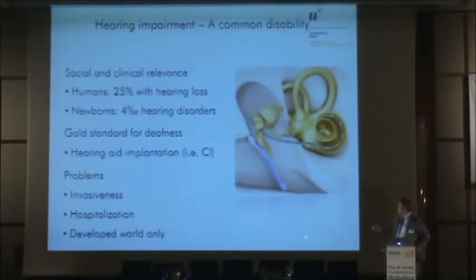So cochlear implantation, you see here the inside of the ear. This is the middle ear with the ossicles. Here's the cochlea. This is a snail-like structure that transmits the sound waves from the middle ear and converts them from a mechanical actuation into impression of the hair cells of the cochlea, which is then further progressed towards the brain. If patients have a significant or complete hearing loss, the treatment is to put an electrode inside the cochlea, and inside the electrode we have little metal plates, metal connectors, and the implant itself sends the signals through the electrode and excites the cochlea hair cells inside.